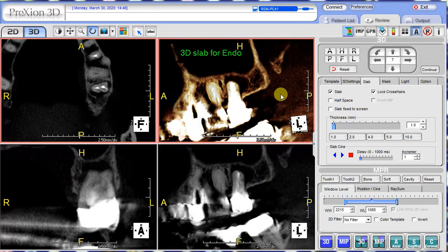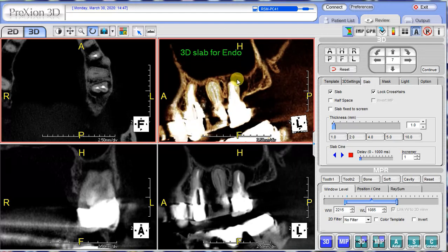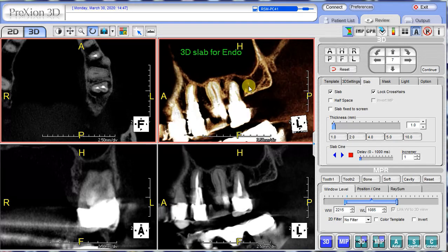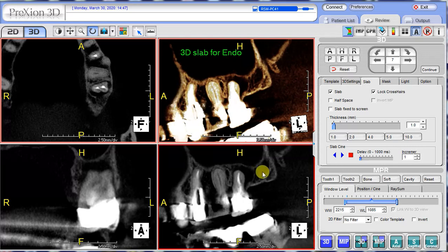Here at the upper left we switch to the sagittal view and perform an evaluation by slicing for radiolucency in the apical region, as well as the sinus floor. You can see the comparison between the two views.